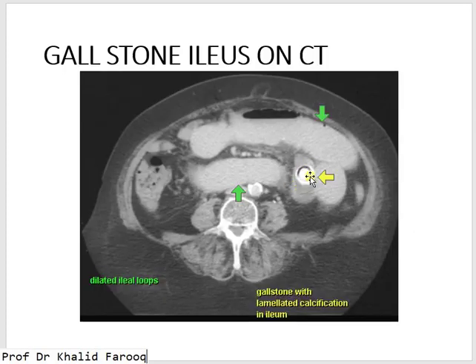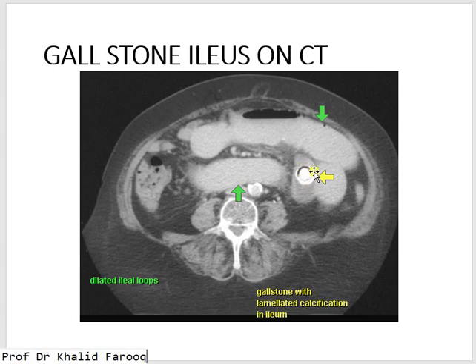This is a gallstone; proximal to the gallstone, the small bowel is dilated. This happens because of a perforated gallbladder — the gallstone causes obstruction of the small intestine when it reaches the terminal ileum. This is an example of gallstone ileus.